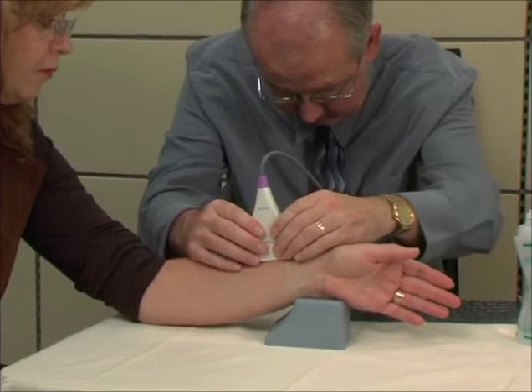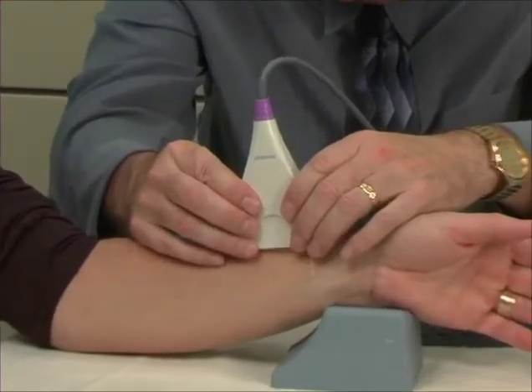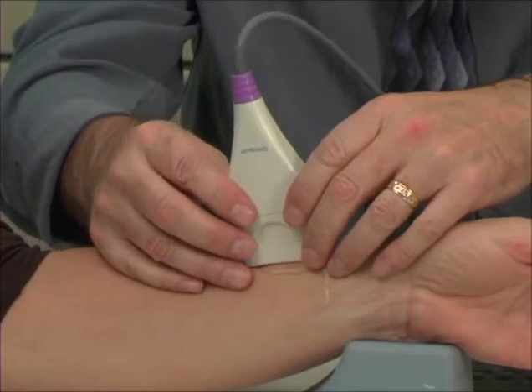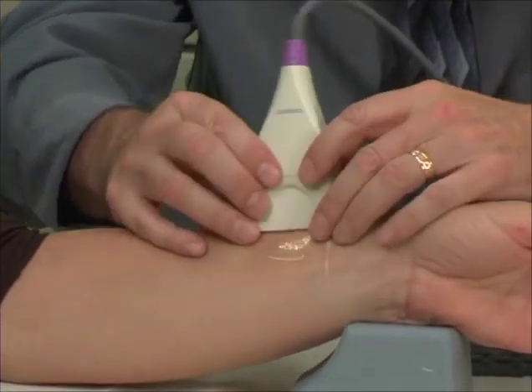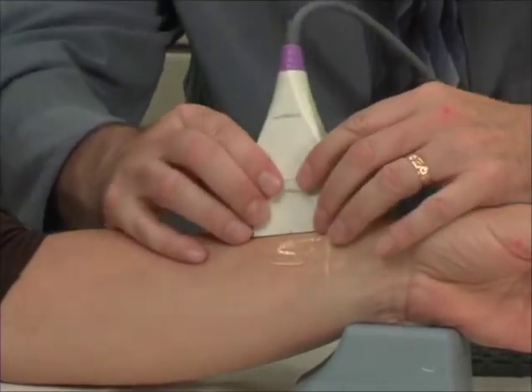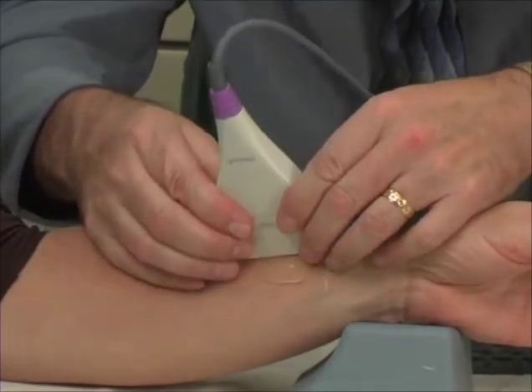Now you'll see that I've got my first, second, and third fingers holding the probe, and my third and fourth as a guide. And I'm going to run the probe along down 70 degrees to this side, 70 degrees to that side as it measures, trying to keep the probe itself flush to the skin the whole time and perpendicular to your arm.